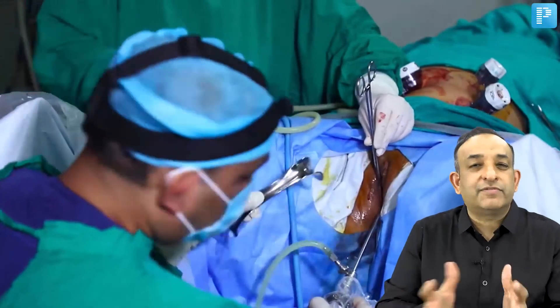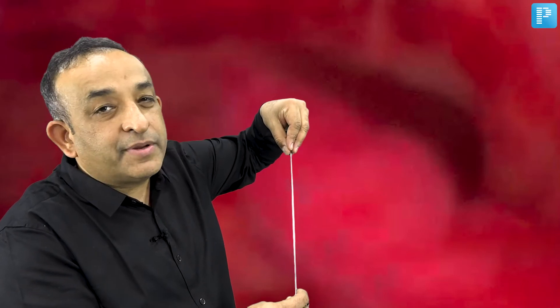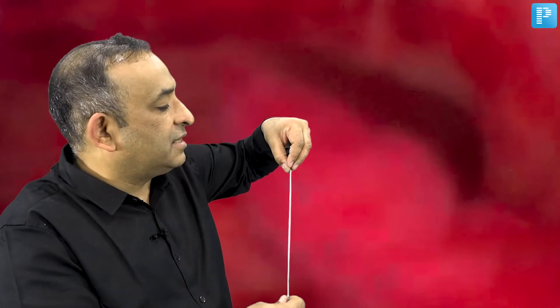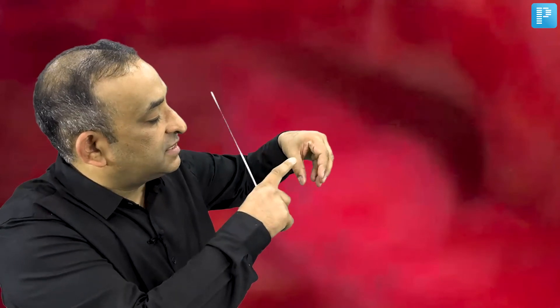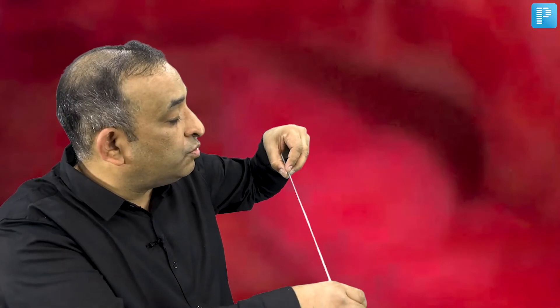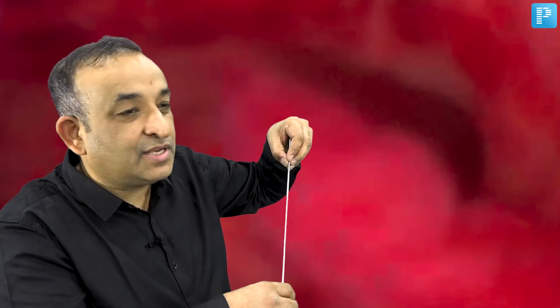After the extensive adhesiolysis, dermoid removal, and chromotubation, we proceeded to hysteroscopy. The hysteroscope is a 4mm scope; when inserted into the uterus, you cannot see anything until you distend the uterus with saline or glycine and bright light. You see the endocervix first, then the cavity, then both ostia. One important point: do not move the scope side to side to look around the uterus, as that bends and damages these expensive instruments.